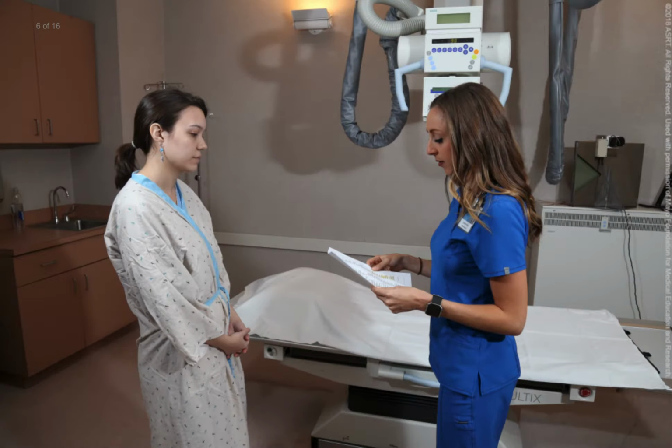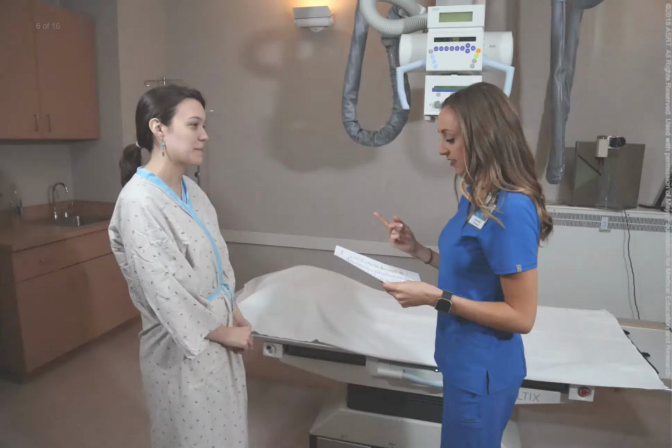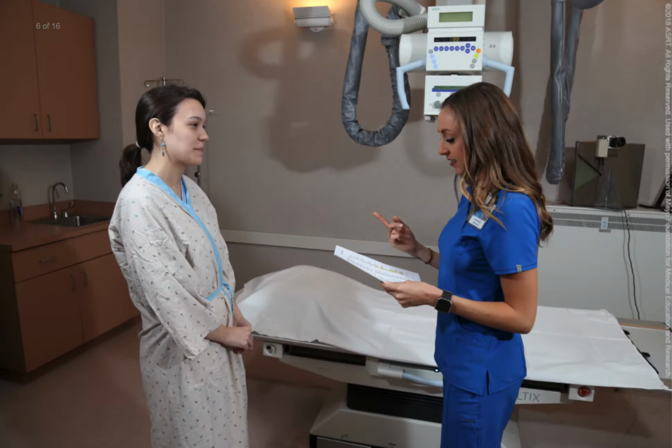Clear communication with a patient will ensure that a proper patient history is acquired and that the patient will comply with all instructions. It is generally good practice to explain the procedure to a patient before exam positioning so that any questions can be answered immediately. When examining the pelvis and hip, it is especially important to advise the patient of palpation methods that will be used to localize anatomic structures before positioning begins.